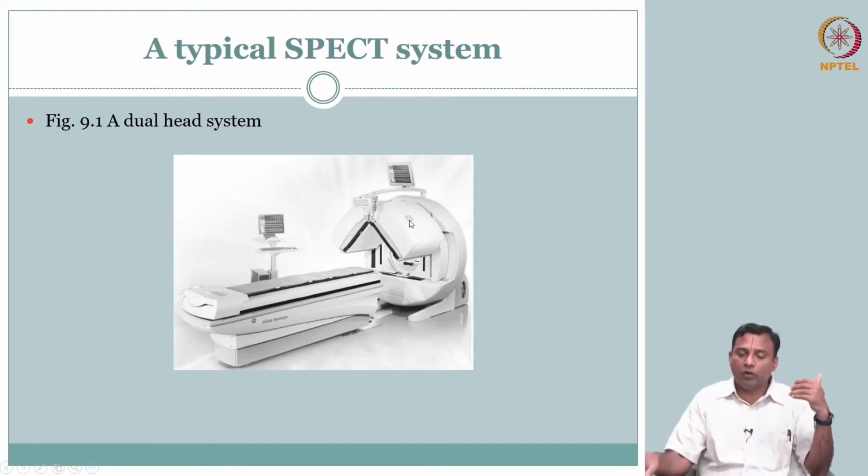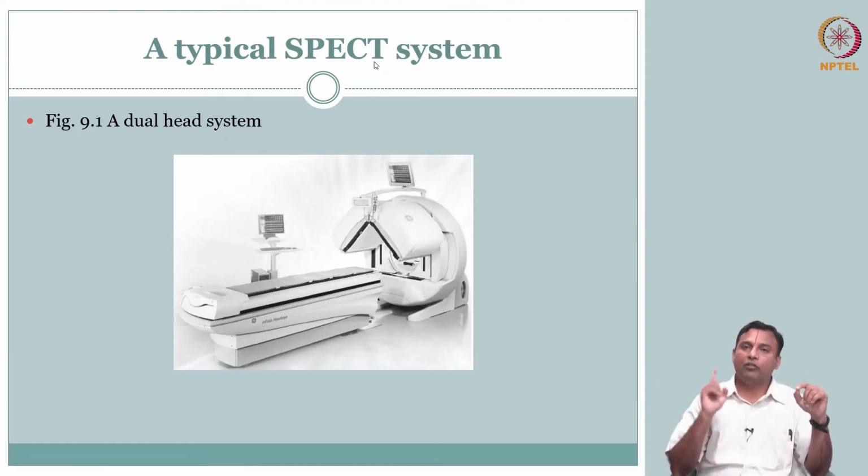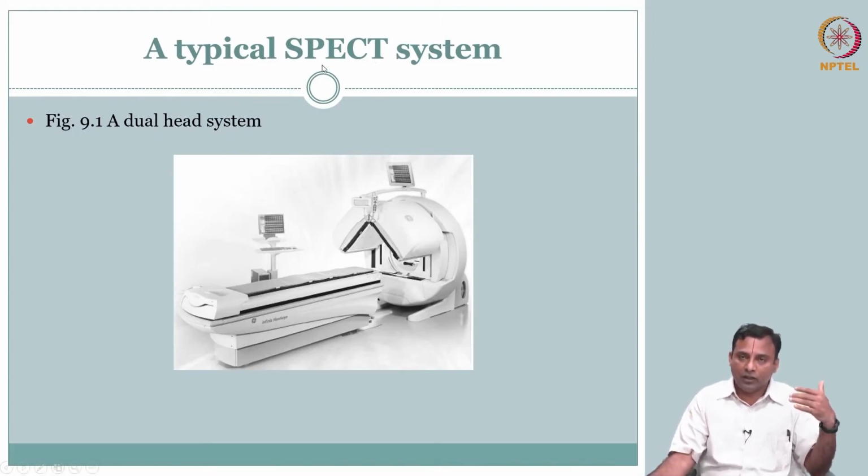So, the same principle as what we did in tomography in X-ray. We had to get data along one line, and then we moved to different thetas. So, we ended up acquiring g of l comma theta, if you will recall, and we will connect back to that. Here we start with the planar scintigraphy concept.